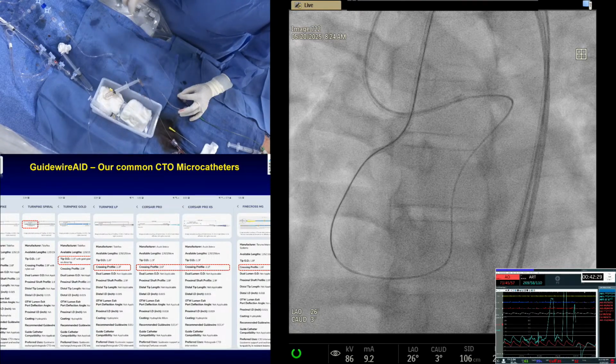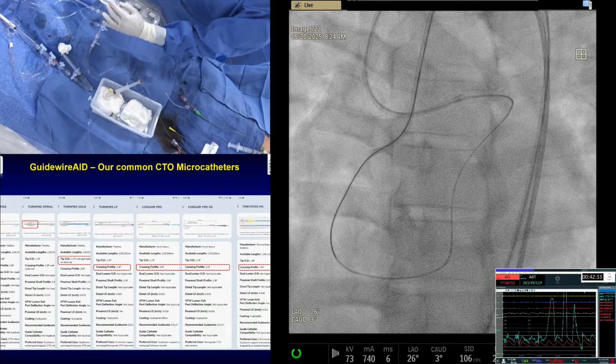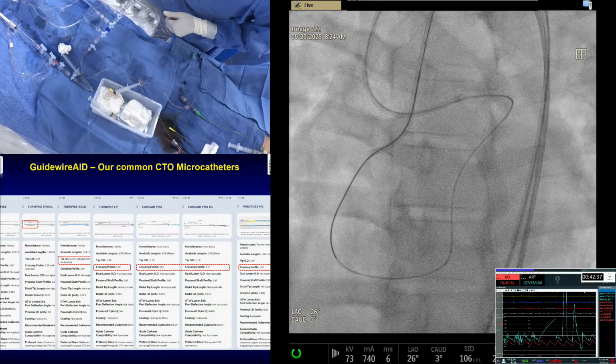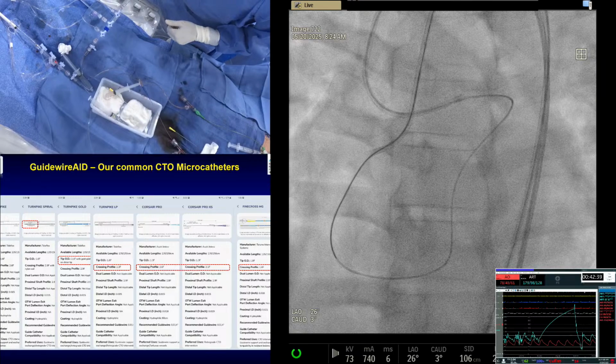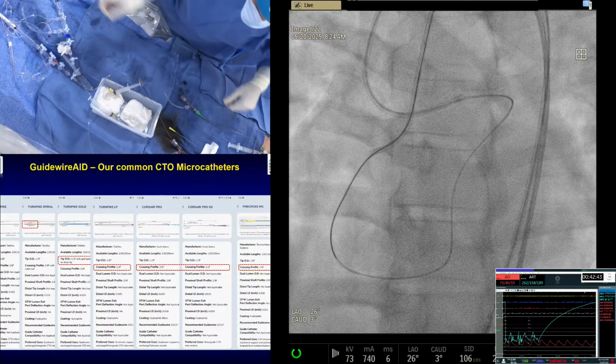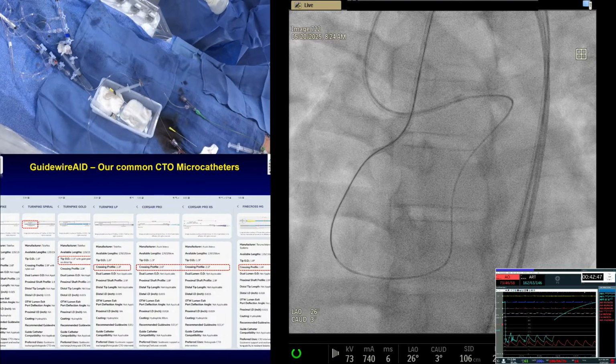So now the question will come: how do you exteriorize, which I emphasized last time step by step, and which wire are you going to use? What are the exteriorizing wires? There are 3. Can you show those slides of all the RG3s? We went through this also last time. Just once again. Which one are we using today?